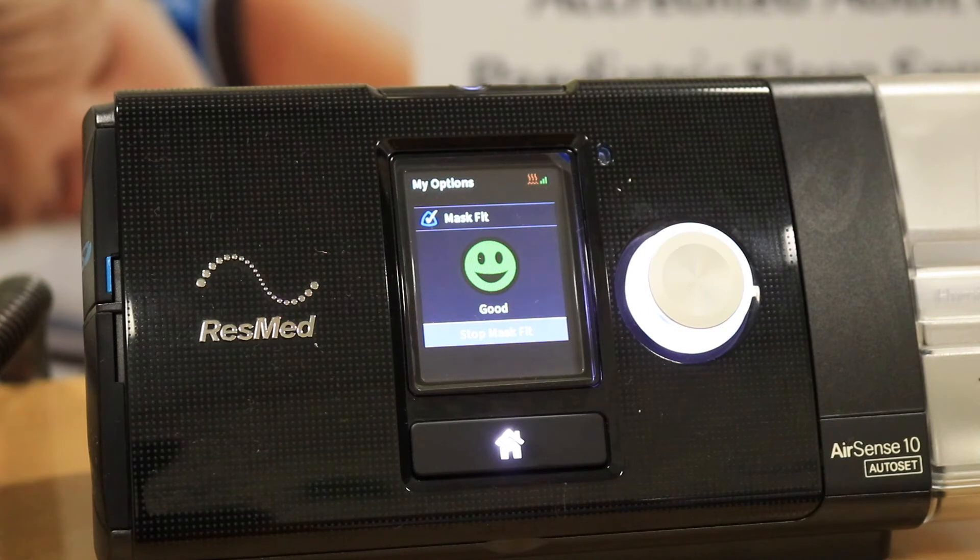As the pressure builds up, if the mask seal is good, you'll see that the green smiling face emoji is on the display. At the moment, we've got a good seal.